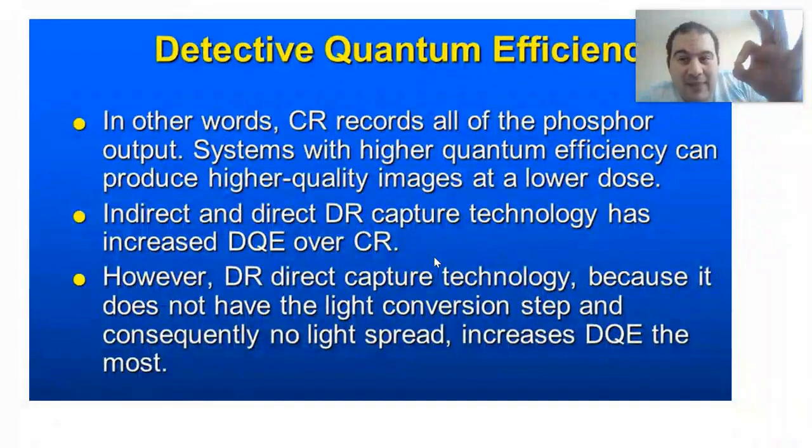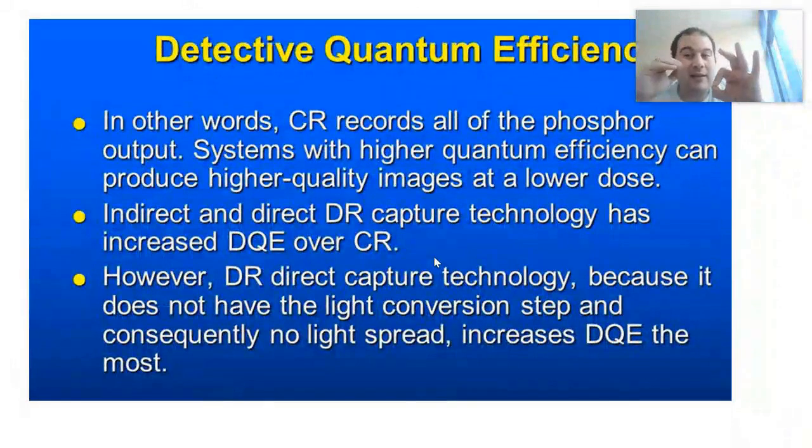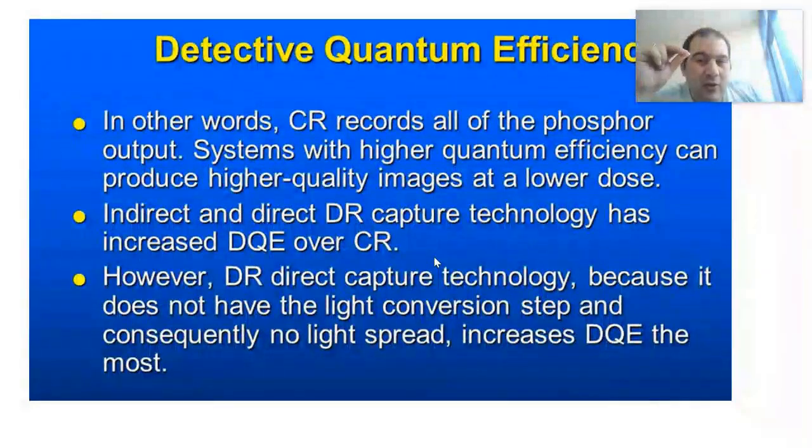In summary, if I'm talking about high values, it means that I have a high parameter because there is no variation between the pixels. The SNR is high, meaning my signal is high compared to the noise, and the noise is low.